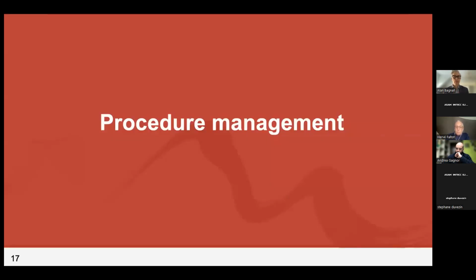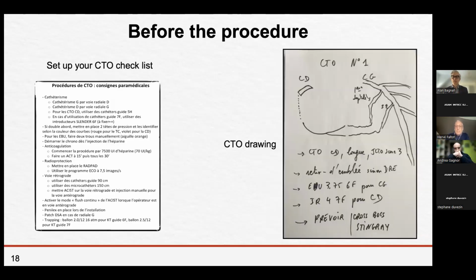The procedure. In my center, I set up a specific CTO checklist in order to not forget any details, for all the paramedic team, before and during the CTO. I also draw the CTO on a paper on the board to explain the CTO, the different materials, and the different strategies you are going to use.